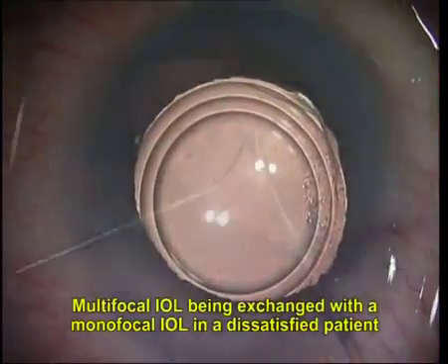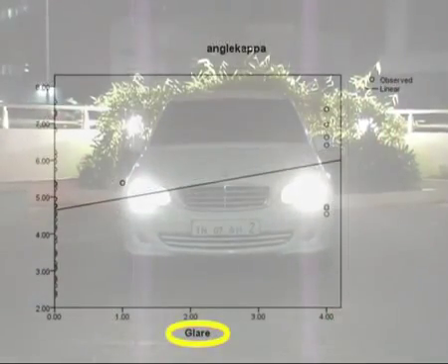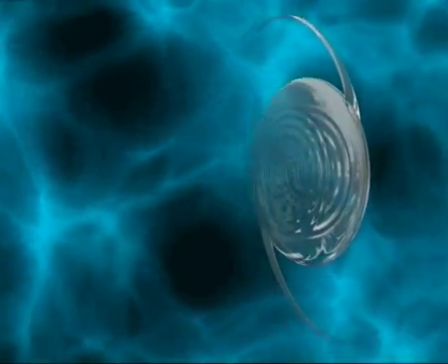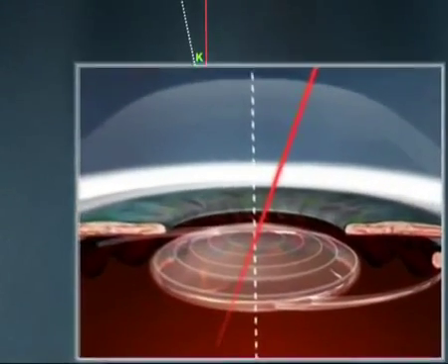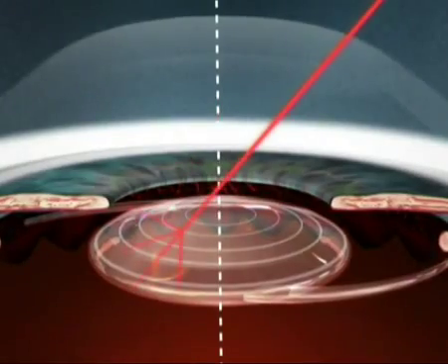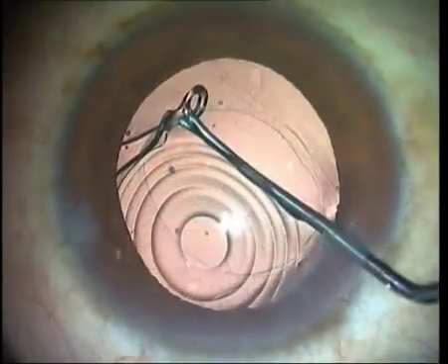We also studied angle kappa in relation to visual satisfaction in multifocal patients and found photic phenomena to have an association with angle kappa. Multifocal IOLs work on either a refractive or a diffractive principle and have either multifocal zones or steps. In an eye with a small angle kappa, the ray of light would be able to pass through the IOL center without disturbance. But in an eye with a large angle kappa, a fovea-centric ray might hit on the edge of the ring, thus giving rise to edge glare effects, etc. This might be severe enough to result in having to explant such an IOL and replace it with a different IOL.